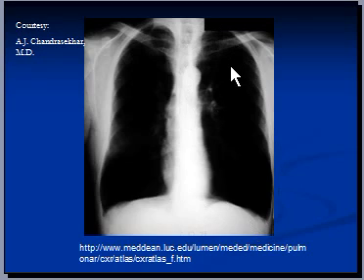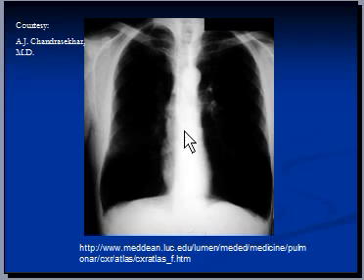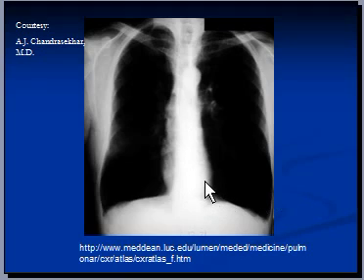Someone may argue that the hyperlucency is a result of overexposure. However, this film is not overexposed because if it were overexposed you would see the thoracic spine. Nowadays we use digital x-rays, and you can see the lung tissue a bit better due to the manipulation available, but this is a non-digital image.